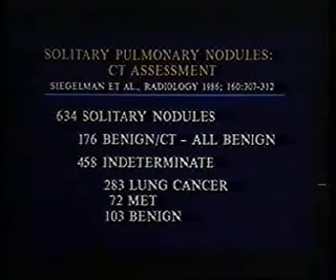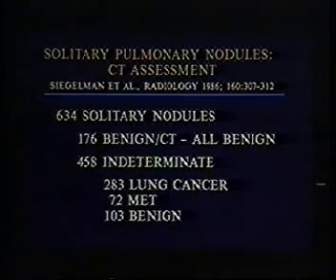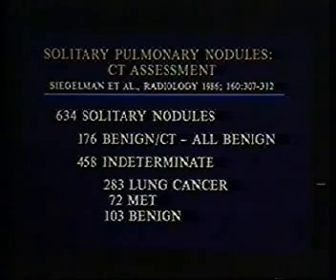Siegelman has gone on to replicate his study in a larger number of patients, simply looking at measured CT numbers in patients with solitary nodules. He has now studied over 600 cases. In about 180, he called the nodules benign on the basis of CT numbers. They were all proven to be benign. So again, you can be very accurate in diagnosing benign lesions using CT and looking at CT numbers. Of 458 that were indeterminate, that is, did not contain definite calcification, a large percentage had lung cancer.